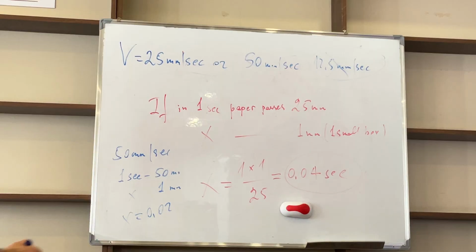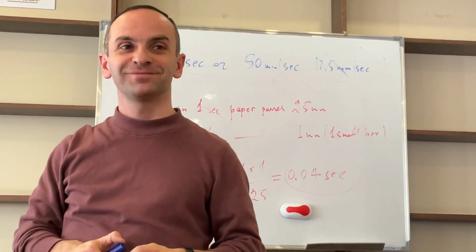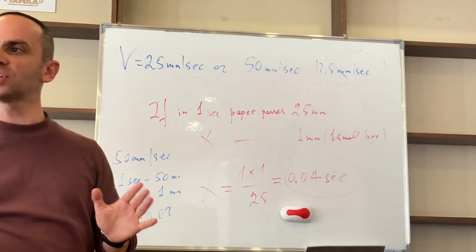Okay? But from this, amplitude is not changed. It is only duration, horizontal size. Vertical size is not changed. Still, we are measuring in the same units.